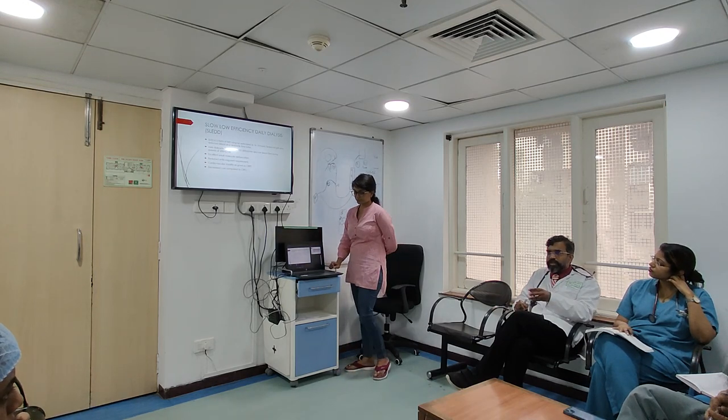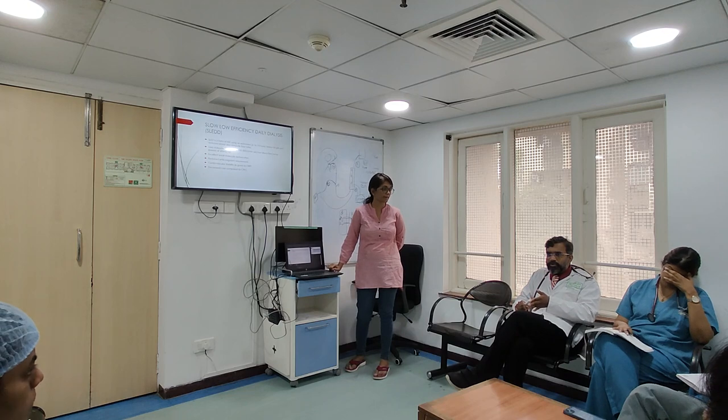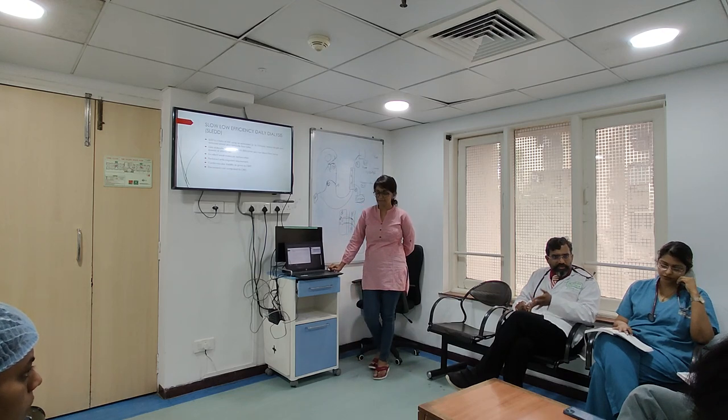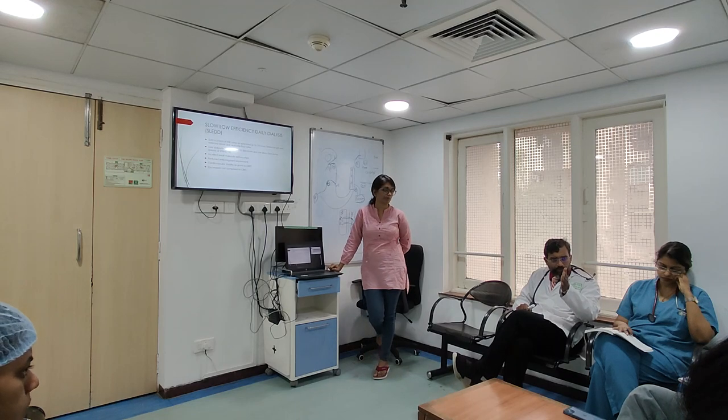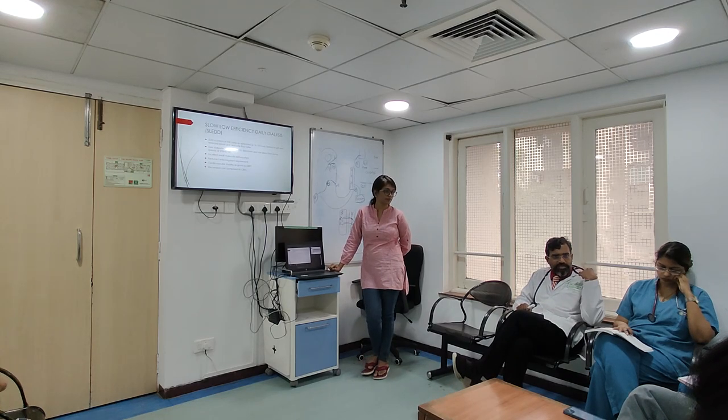Hemofiltration. But I need a filter, no? I need a semi-permeable membrane, no? Yes. That's why when I started the lecture, we said intermittent hemodialysis, we can do diffusion as well as ultrafiltration. This is what I mentioned, isn't it?